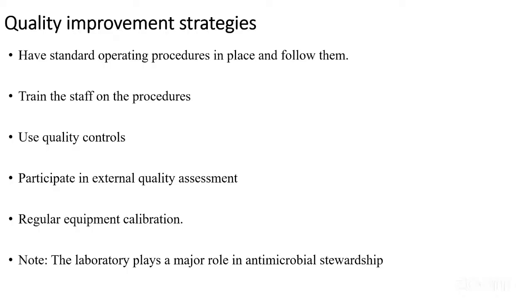Also, you should use quality controls in all your analytical methods. Check if your strips are okay. Check if your culture media supports growth. Check if your culture media is sterile. Check if the drugs that you are using are okay for use, fit for use, and if they can inhibit organisms. Use known organisms with known zones of inhibition, so that you can check if you have reagents that are fit for use.